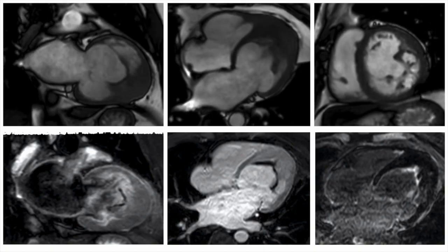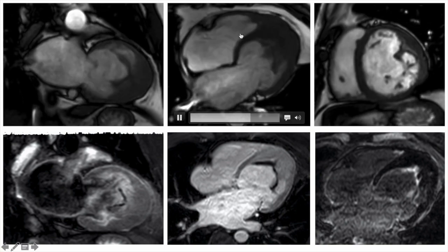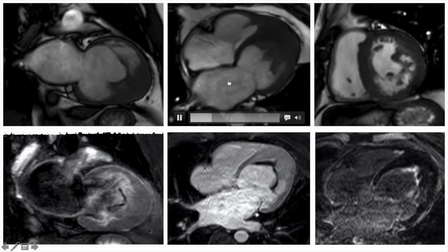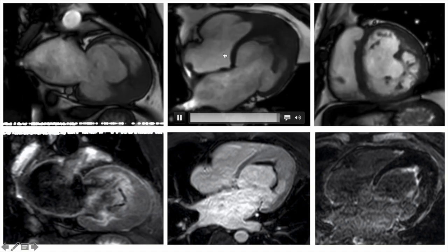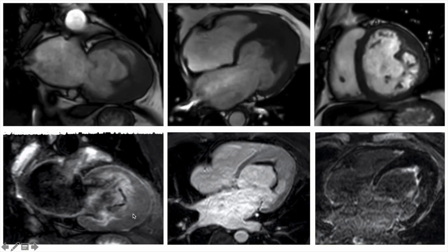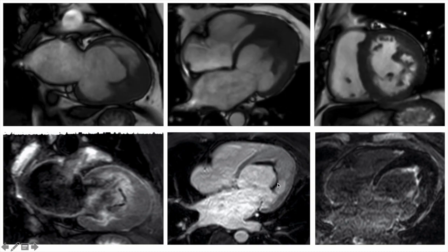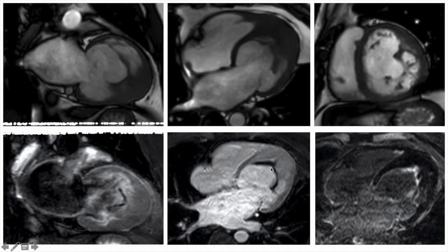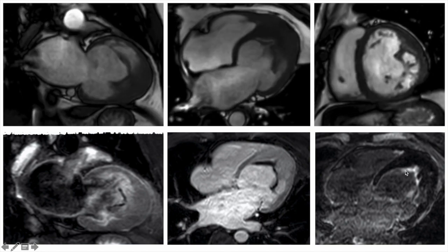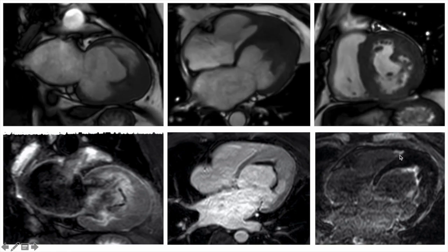This is a 40-year-old female whose cine images show distortion of the RV and LV cavities with diastolic dysfunction, resultant biatrial dilatation, and mild AV valve regurgitation. The STIR image reveals mild subendocardial edema. The early gadolinium enhancement image shows the typical layered thrombus in the LV cavity as a hypointense structure, while the late gadolinium enhancement image on the right demonstrates the subendocardial fibrosis and scarring as enhancement.